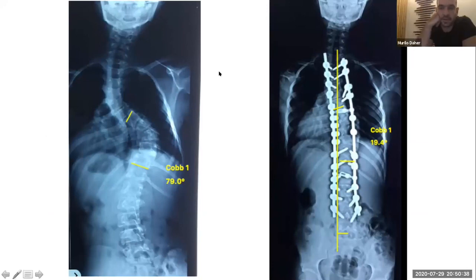Rafa, may I make one comment? I think in this curve, the pedicle screws that you put in the convexity are very important, because you know that neurofibromatosis curves are very aggressive and sometimes they progress even though you do a posterior fusion. So I think of the derotation that you made with the screws in the apex, but also the 3-column fixation that the screw provides, it is very important in this pathology. In neurofibromatosis, the more you fixate on the apex, the less the chance of progression of scoliosis and everything. Very nice case. I agree, I totally agree.